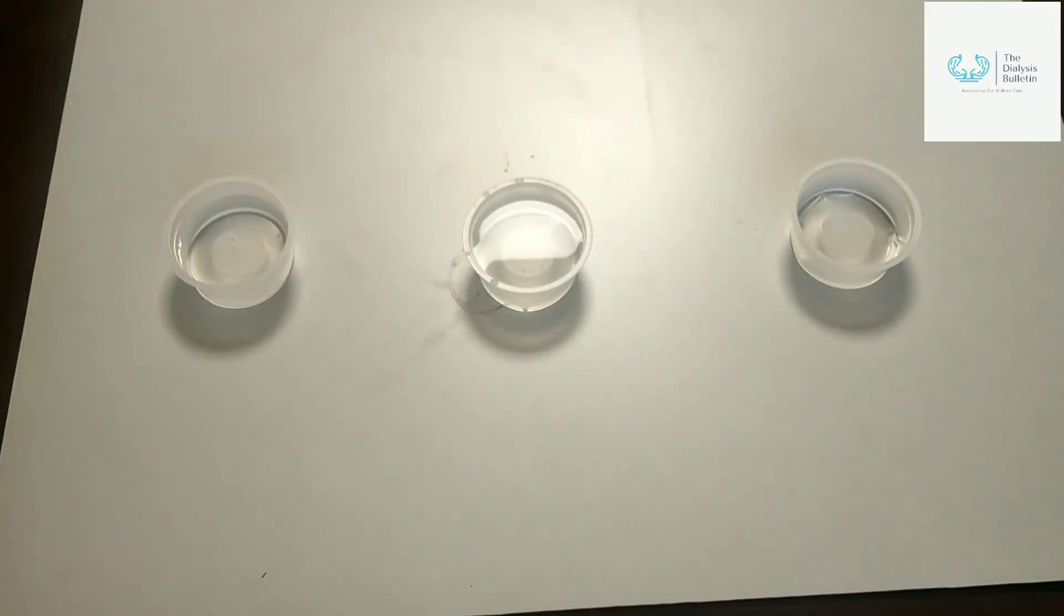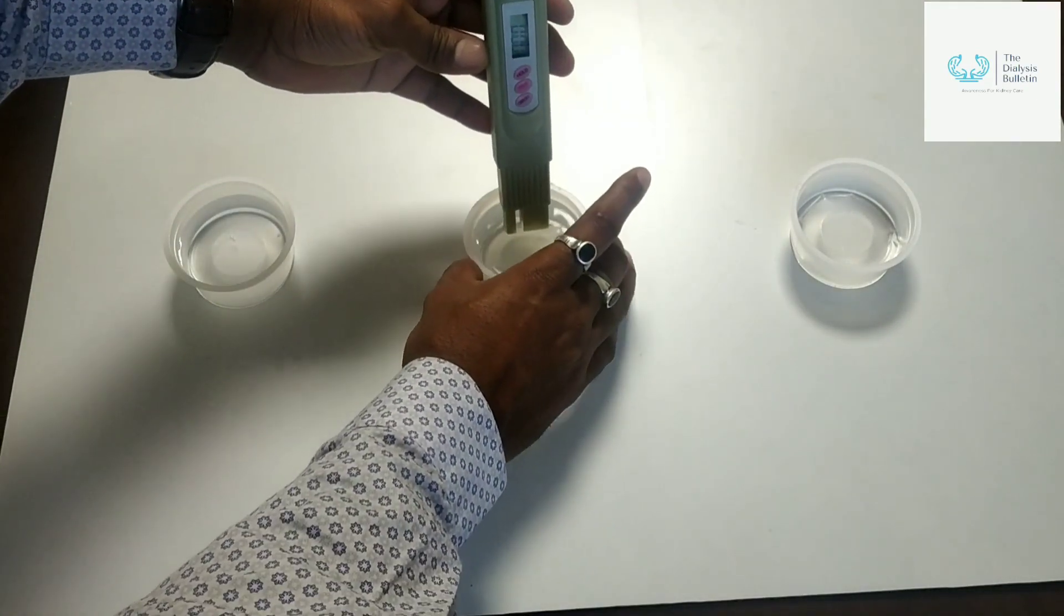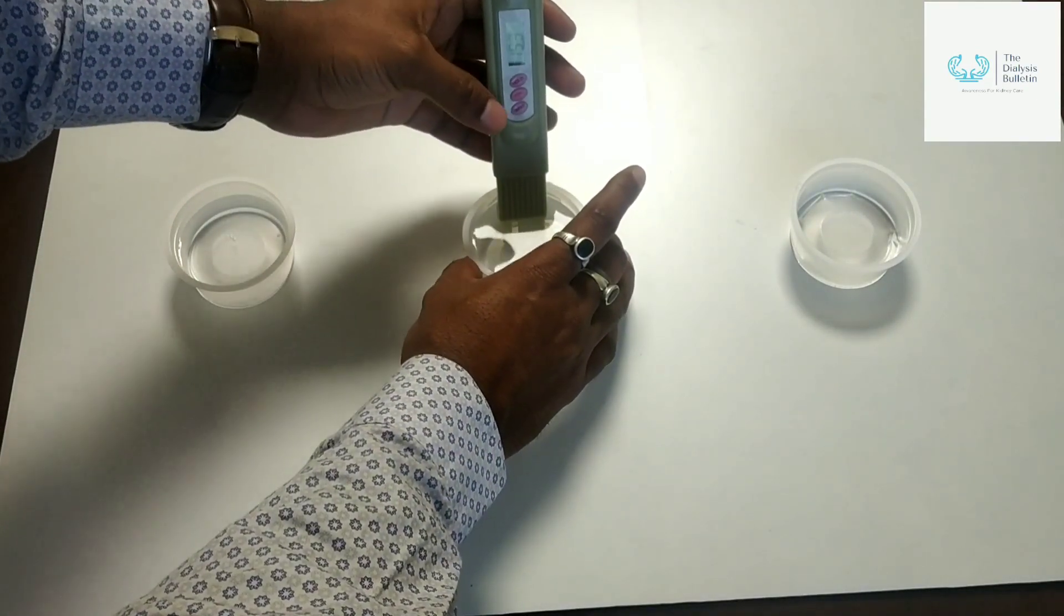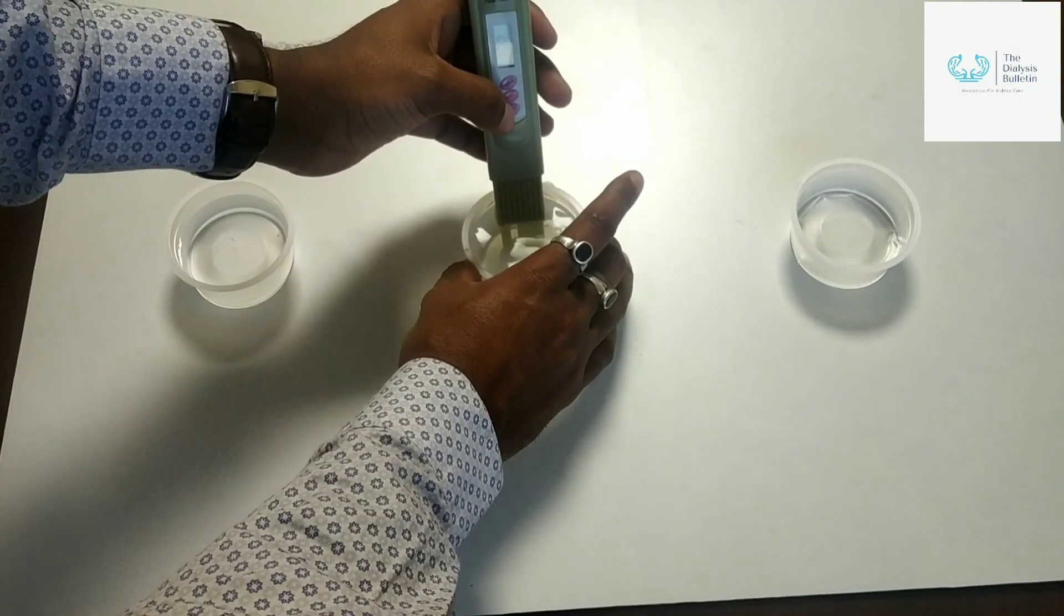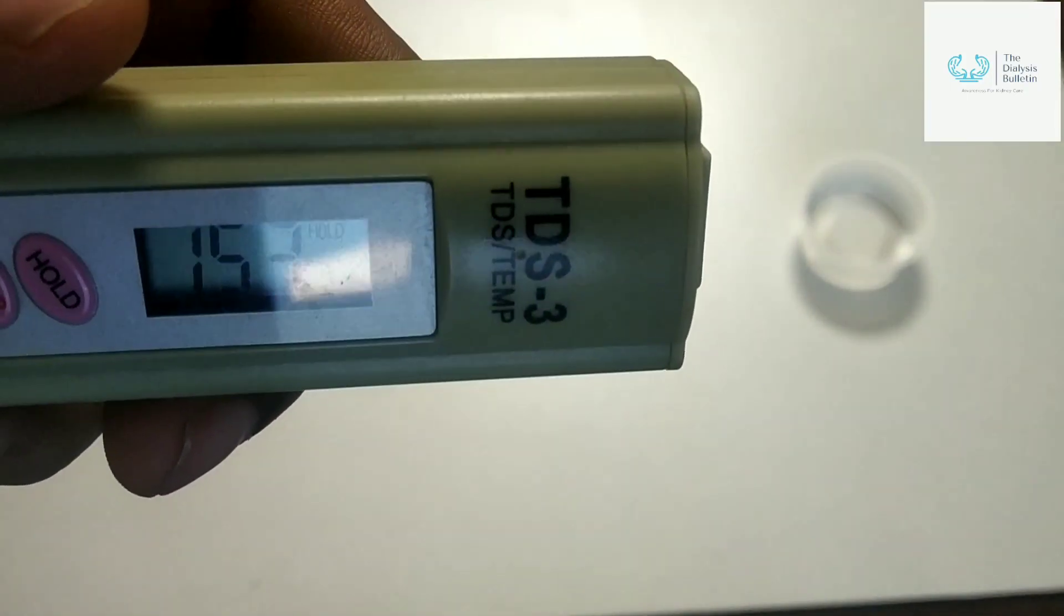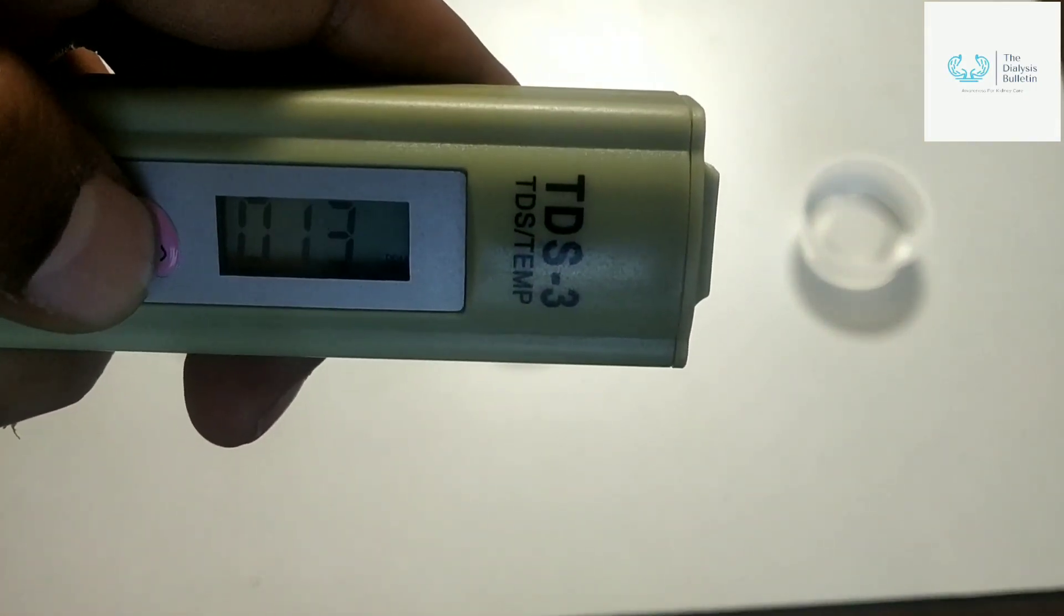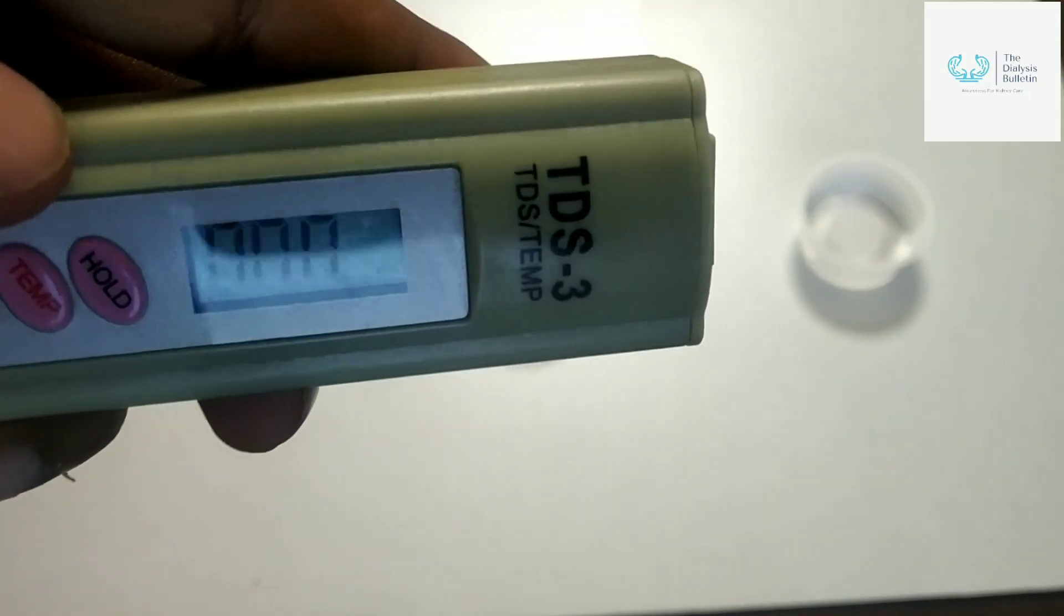Now we will check the post-softener water, which is here. The post-softener water is 153 PPM. Now I am going to unhold. It's now again at zero.